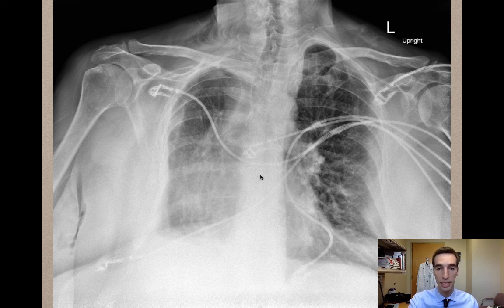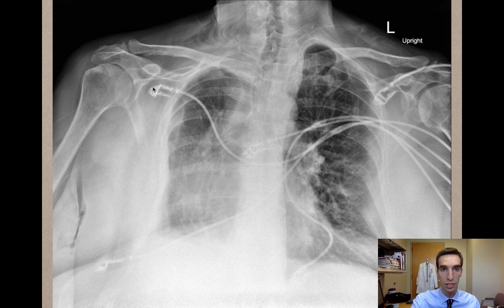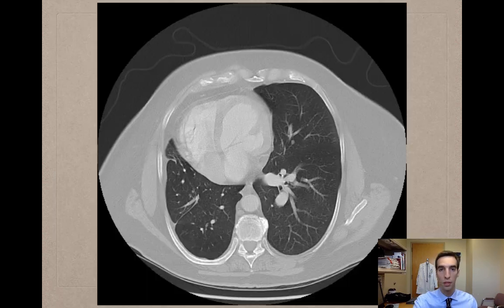The final part of the mnemonic is everything else. So you can look for perihilar lymphadenopathy, you can look for air in the soft tissues, you can look at the chest lead placement, and you can look for foreign bodies.